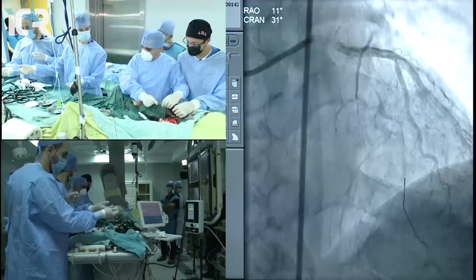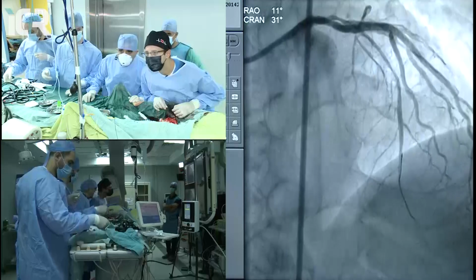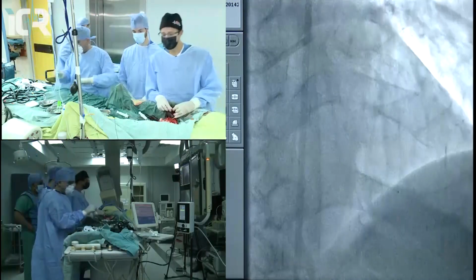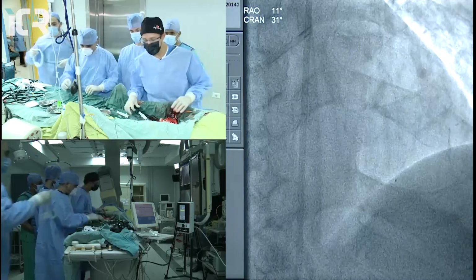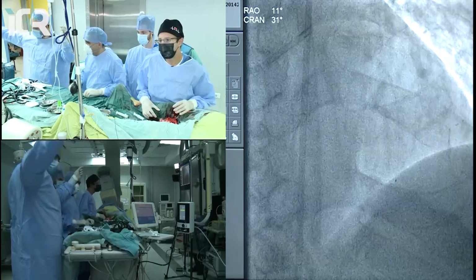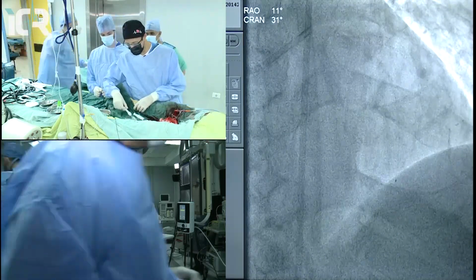So you will do first the diagonal branch stenting. We need the 2.5 by 28 or 23 stent. I think 28 is better, yes, to extend more inside. Now the microcatheter passed very smoothly, so I think that's a good sign. We'll now get a BMW wire and put a wire in the diagonal, do pre-dilatation and stenting, crushing, and then kissing and a stent in the LAD, and then final kissing and POT, which are the steps of the DK crush technique.